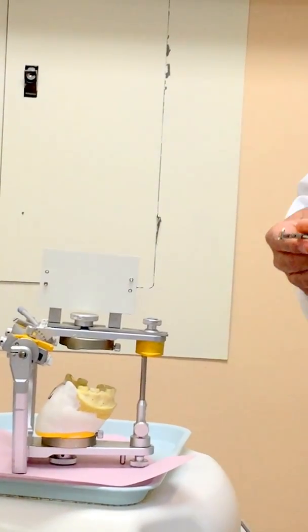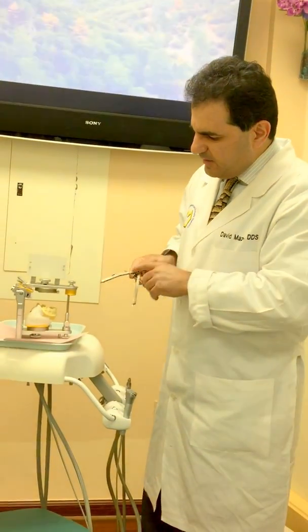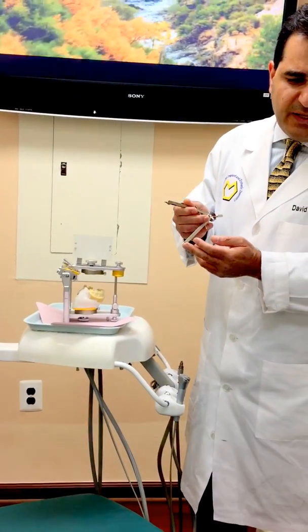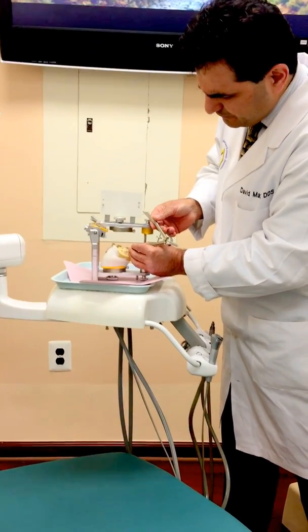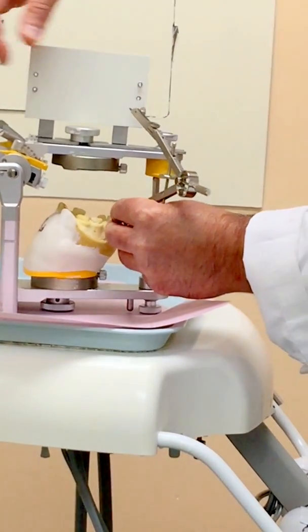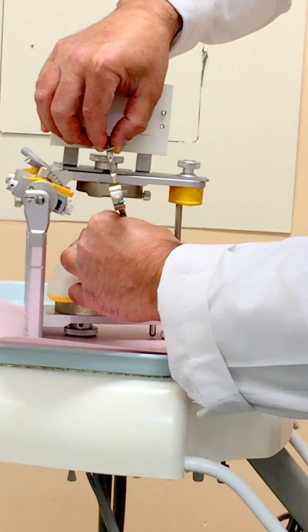We need two points. The first point is the ASP, or anterior survey point, which is going to be the distal incisal angle of the mandibular canine. I'm going to place the center point of the compass on that angle, then go ahead and apply a long arc using the graphite lead — drawing and applying an arc.